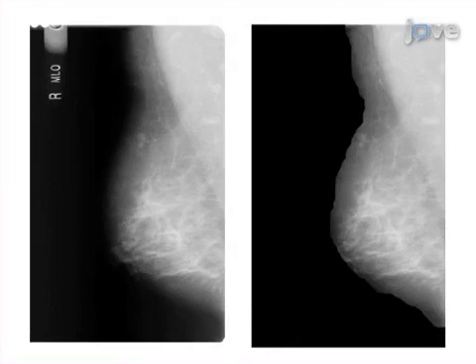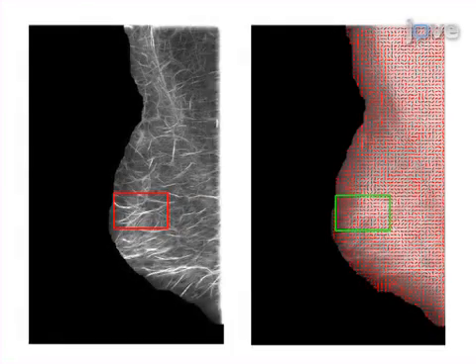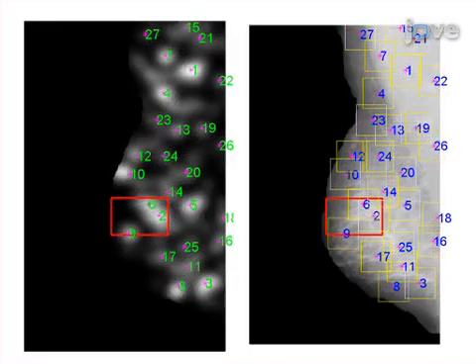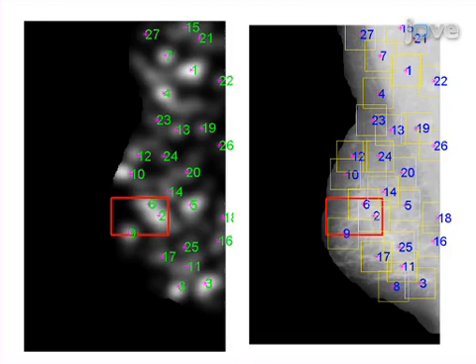The second step is to detect oriented structures in the image by applying a bank of Gabor filters. Next, the orientation field is analyzed using phase portraits to detect node-like patterns that could indicate the presence of architectural distortion.